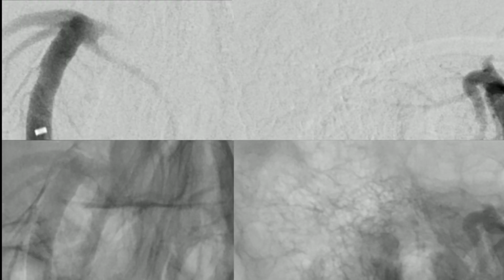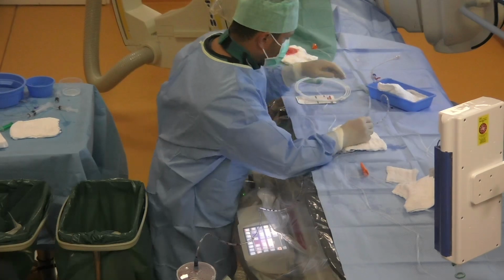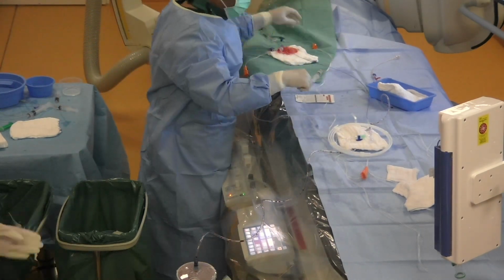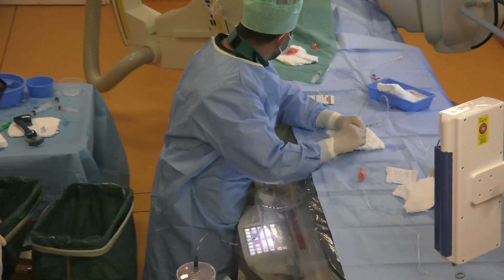And now, as you can see, after taking our working position, the stenosis got occluded. But according to the 3D angiogram, we know how we can navigate through the stenosis. We take our PTA balloon catheter, Neurospeed 1.5/8, and insert the microwire into the balloon catheter.